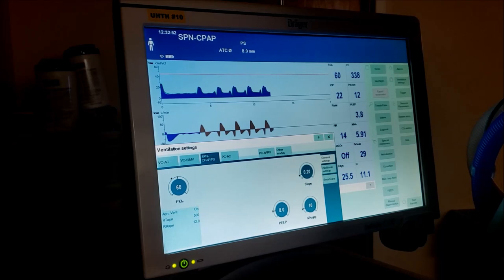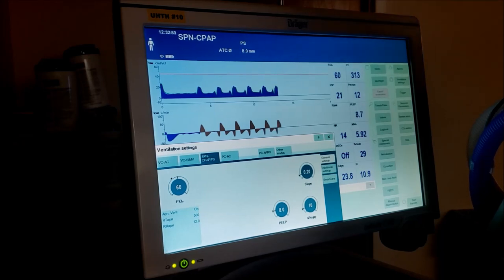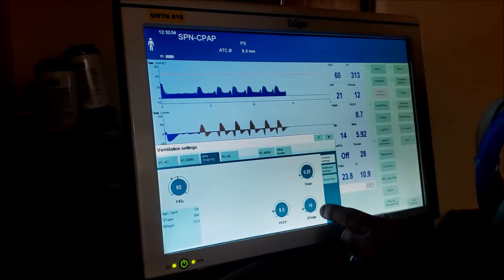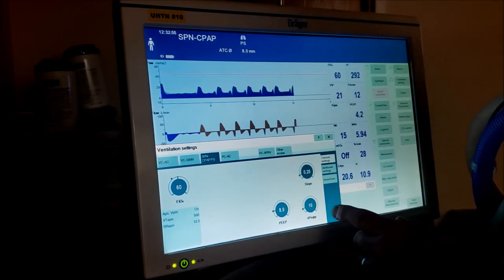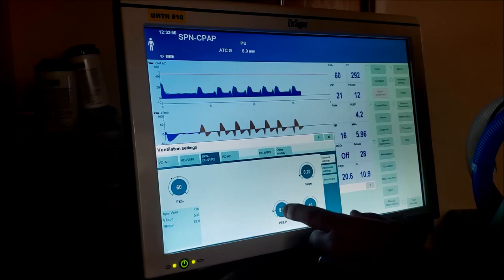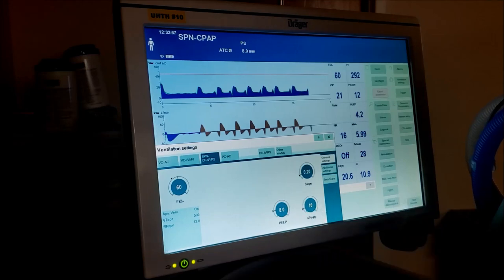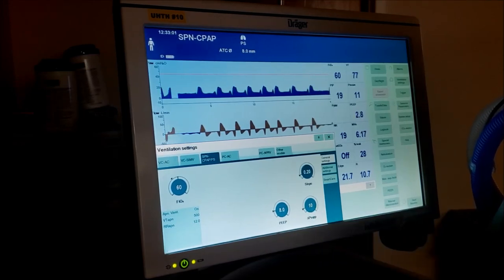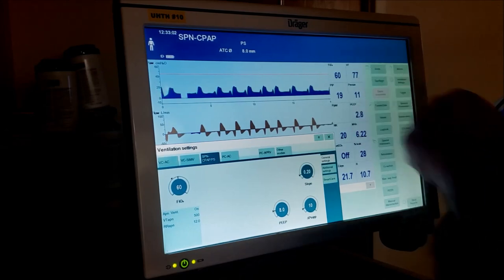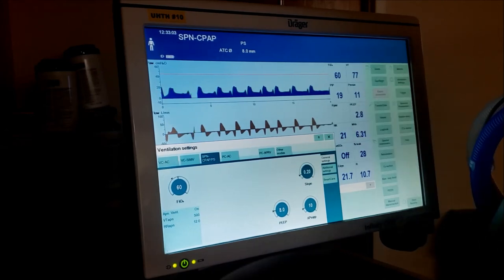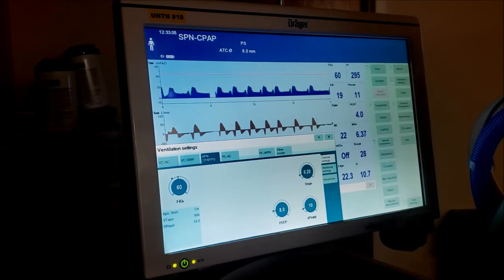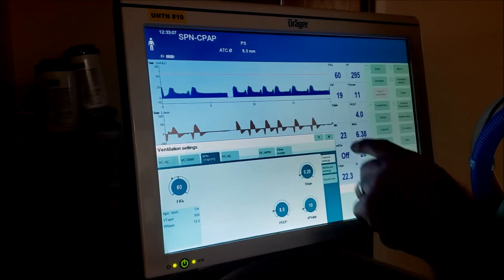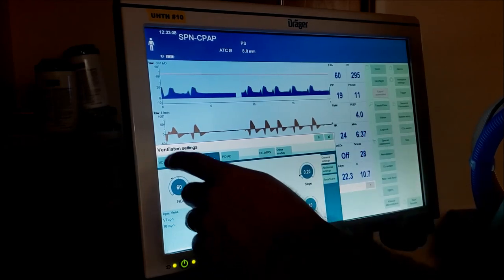Every time they take a breath, it's giving them 10 centimeters water pressure over their 8 of PEEP of support. What we're going to look at in these cases when they're taking spontaneous breaths is: is their exhaled tidal volume appropriate for what they need for the size of person they are?